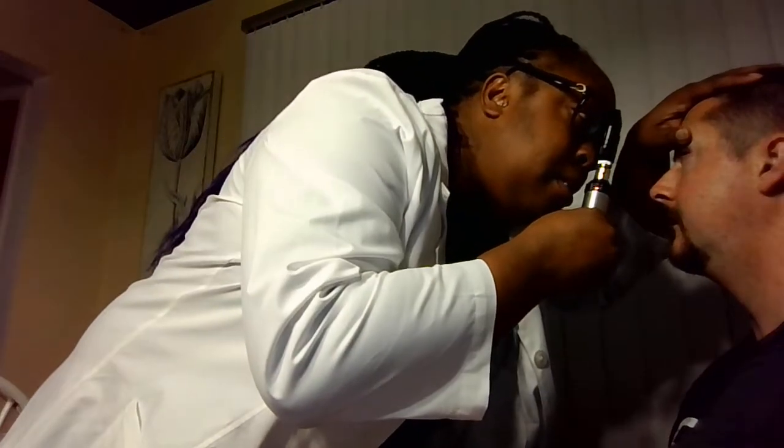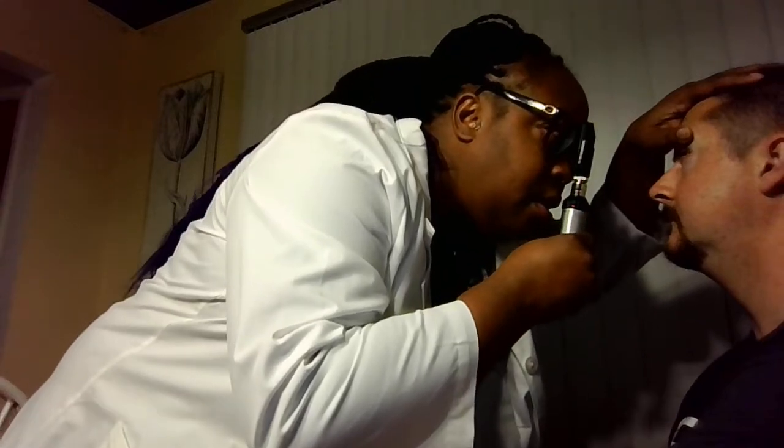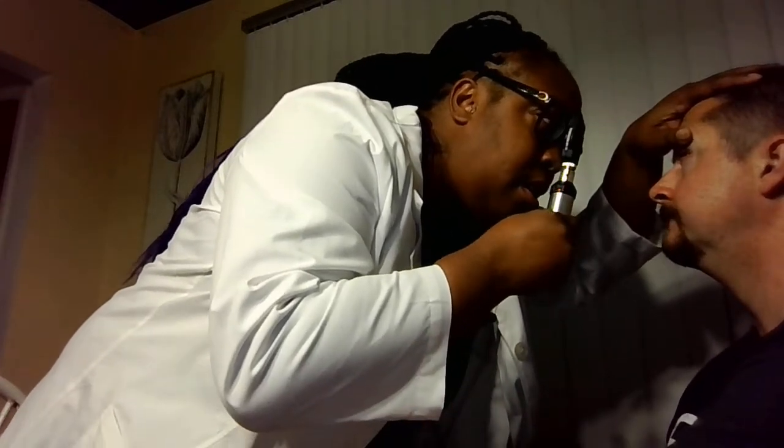All right. And then I'm going to do the same with the left. I'm going to check my left eye to your left eye. And I'm going to come in. Good. And I'm checking. All right. And that looks good. All right, so your eyes look good.